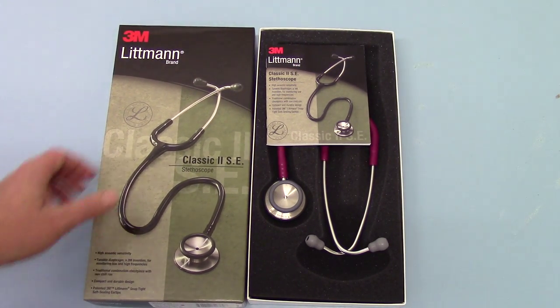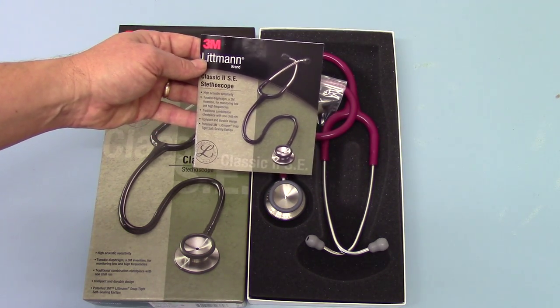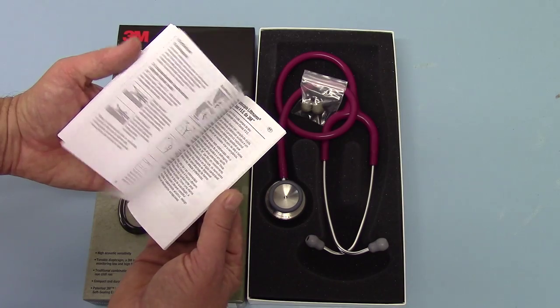Moving to show you the actual stethoscope and what you get in the pack when you purchase one, you get a multi-language Classic 2 SE insert which basically runs you through the stethoscope and how to use it in multiple European languages.